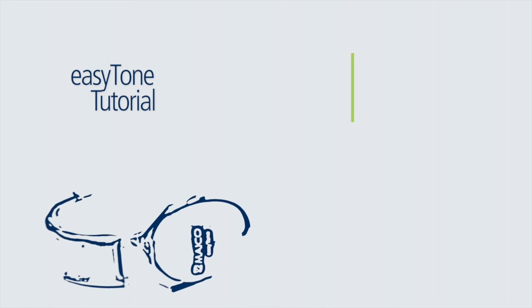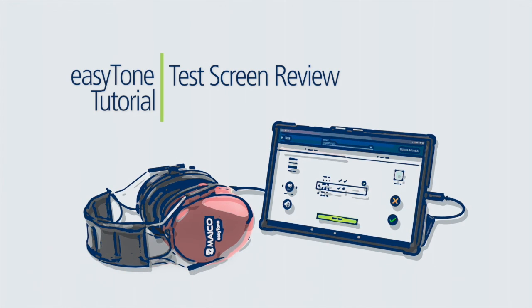This completes the tutorial on the test screen operation. Please continue through the tutorial series for additional easyTone instruction.